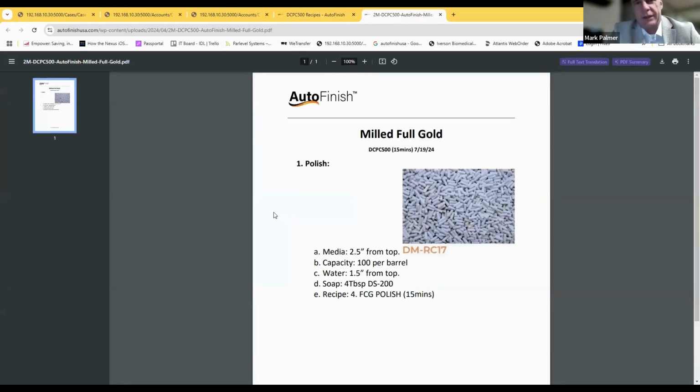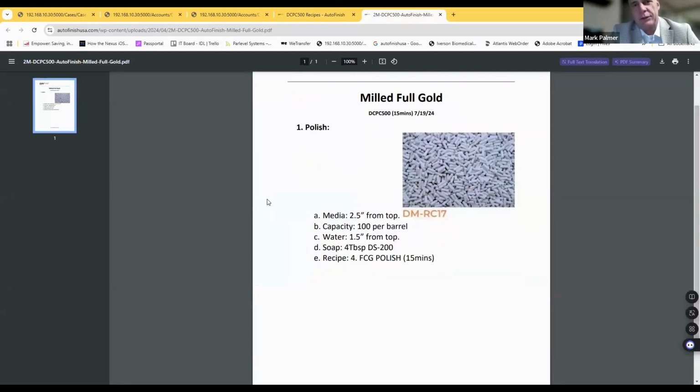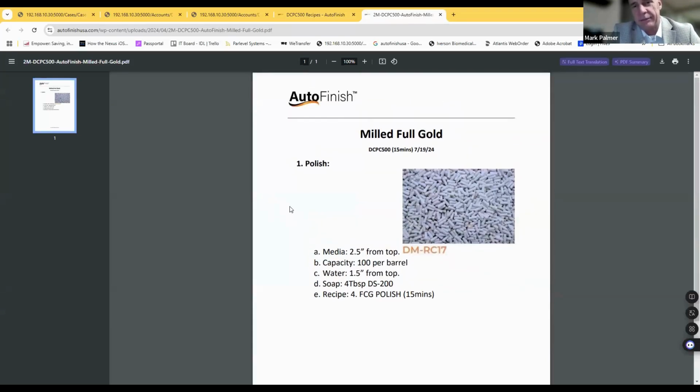From a time saving perspective, Travis, as you're going through these products, which product do you see the most savings on labor in, just one? I know you probably do more dentures or more this or more that, but if you had to pick one product for your team, if they had to say, I would never want to do this product again, which one is that? Yeah, it would for sure be flexible partials.